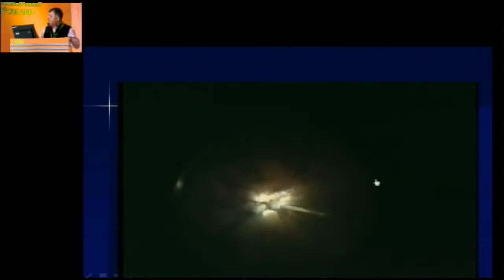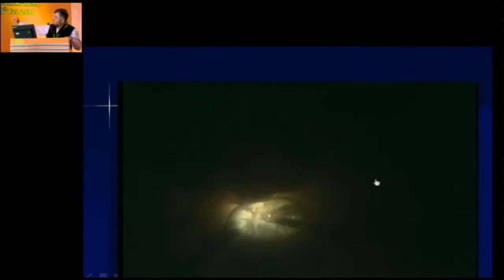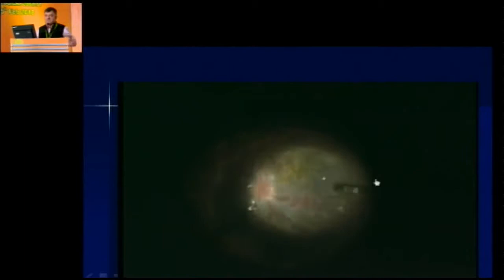And now look at this retina, maybe detached for we don't know how long. These are such stiff folds that you have to now use the PFCL and keep on removing layer by layer. You may be there forever almost. And once you remove that, you find more space, inject a little more PFCL. So keep on going. You see, it's getting somewhere there, which in fact, I had told them, I am doing a mercenary surgery, maybe it doesn't work at all.